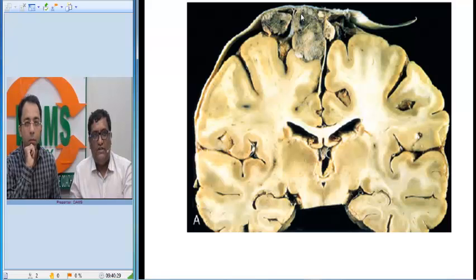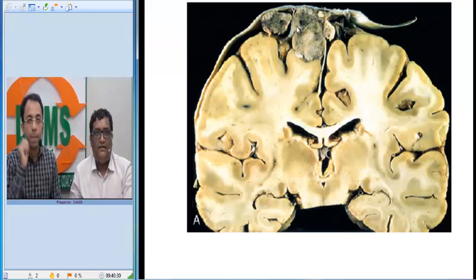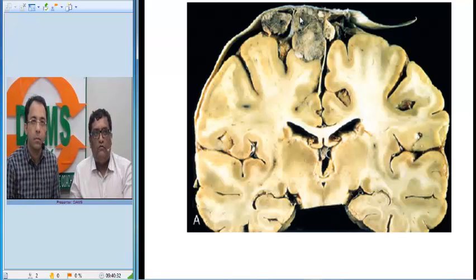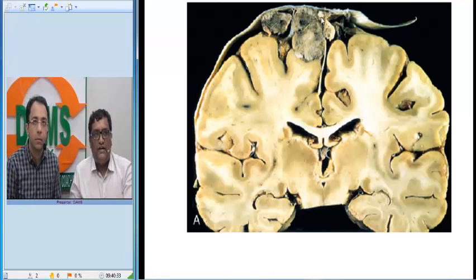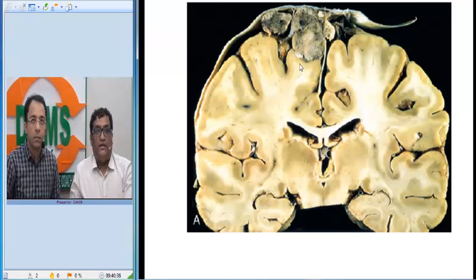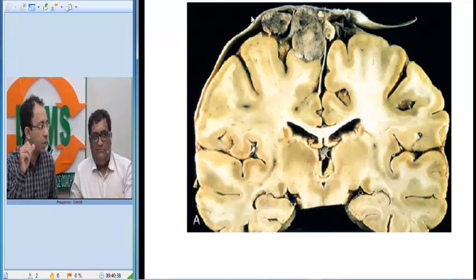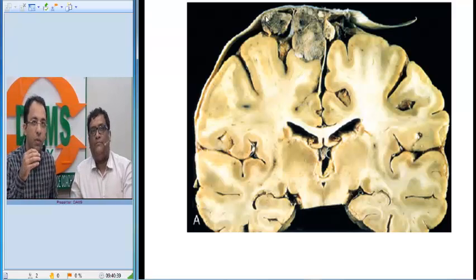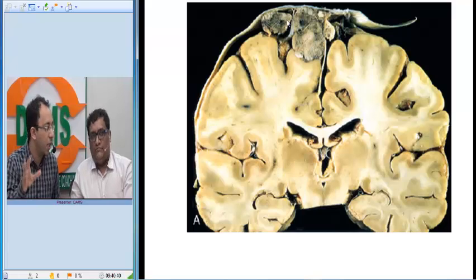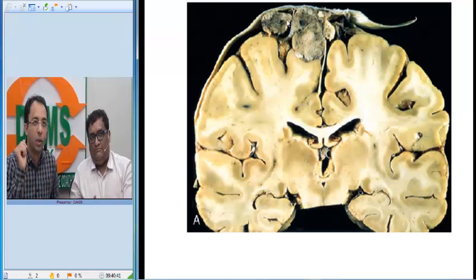I can definitely see here it is arising from the coverings of the brain. On gross examination, this is a tumor which is definitely not infiltrating into the brain parenchyma — the same thing also seen on radiology, which we call extra-axial location. The same thing seen on gross is what we also see in radiology.